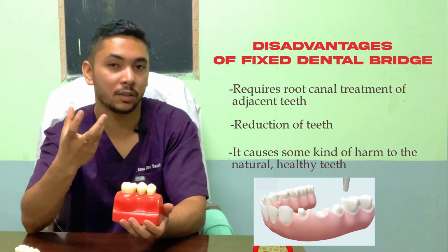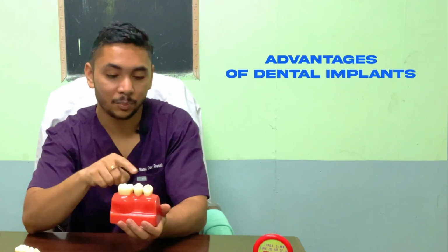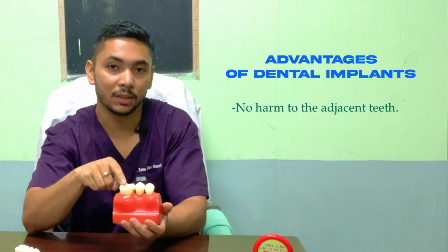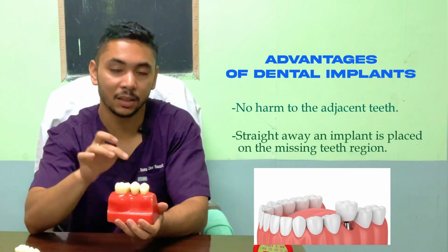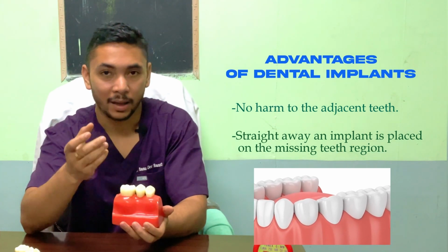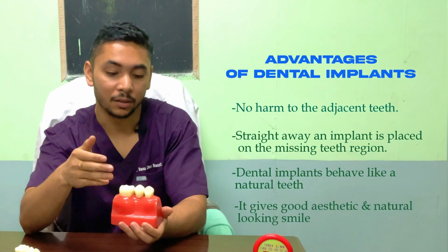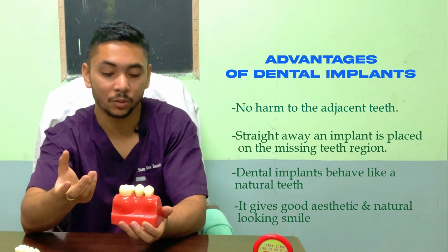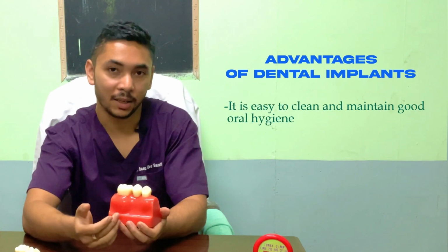So we are causing some harm to these natural teeth which are already healthy. In dental implants, this procedure is not required. We don't even need to touch these teeth. There is no harm produced to the adjacent teeth, and straight away an implant is placed in the missing tooth region, and then a crown is placed to replace the missing tooth. This is one of the most important advantages. And the dental implant behaves like a natural tooth. Talking about aesthetics, the aesthetics is very good, and when you smile it gives a natural look. It is also easy to clean and maintain good oral hygiene.